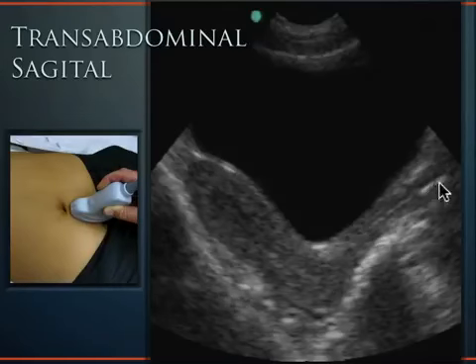Now, this hyperechoic line, this white line that you see right here, that's the vaginal stripe. That's actually the walls of the empty vagina all caved down on itself, and you get an echogenic line like that. Going from the outside world into the vaginal vault, you terminate at the cervix, and then you have this sort of 90 degrees where the uterus comes off that way. That's the anatomy there. It's a little confusing at first, but over time it makes sense.